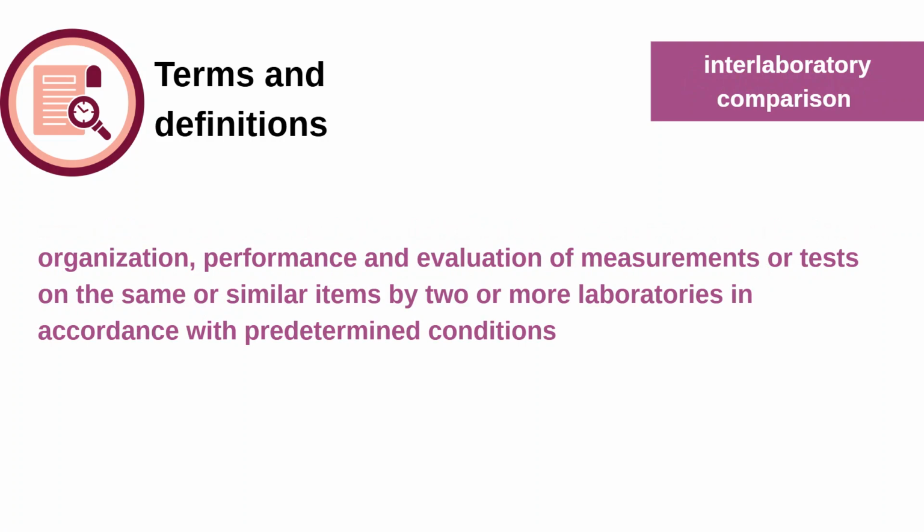If there is a permissible limit or error range, what you can call a tolerance level, and the deviation is beyond that limit, which depends on the equipment, then some other action should be taken, usually calibration of the master equipment. So all these things come under inter-laboratory comparison.